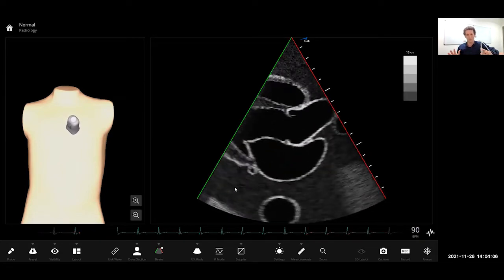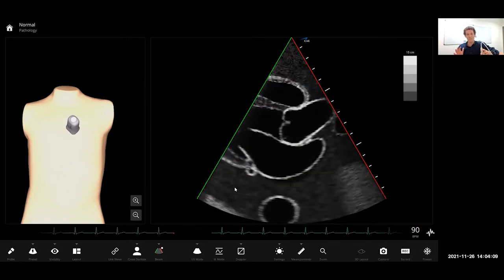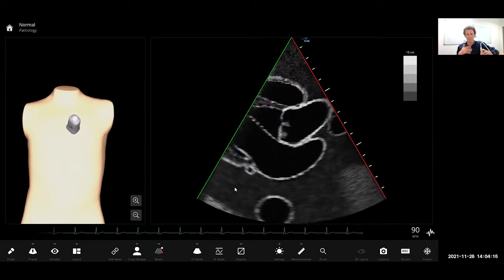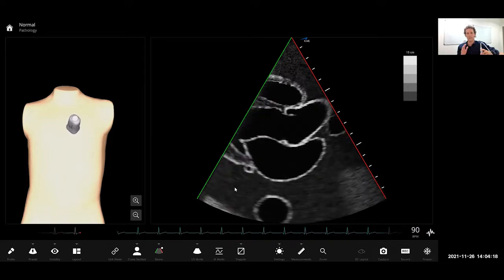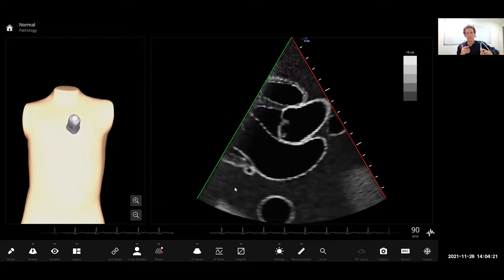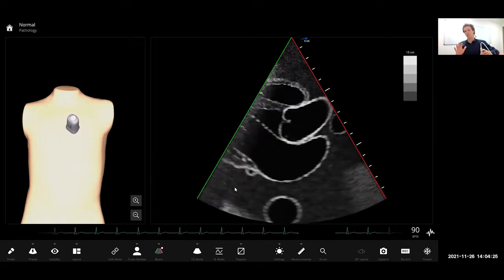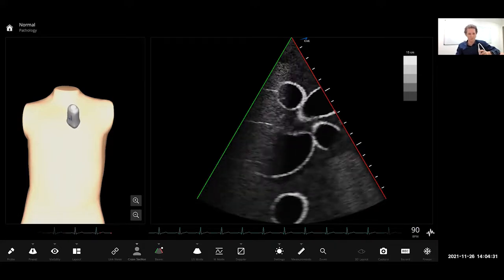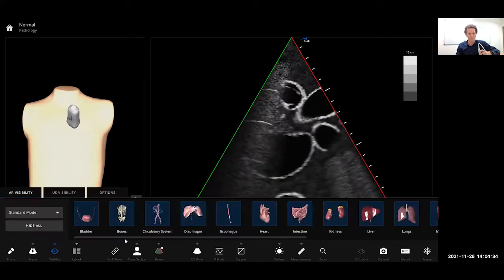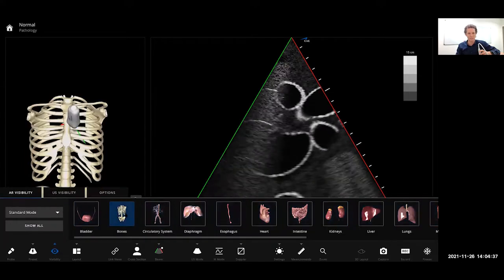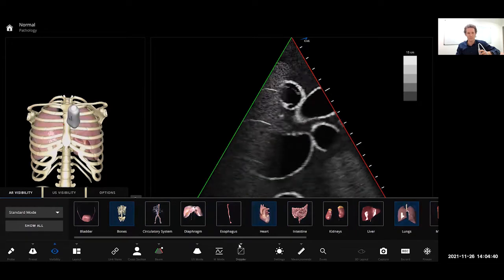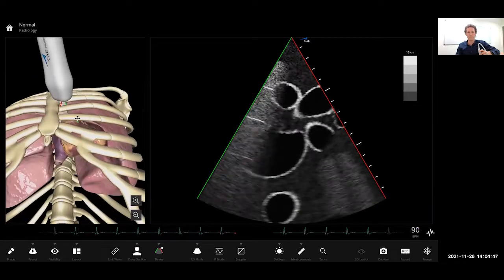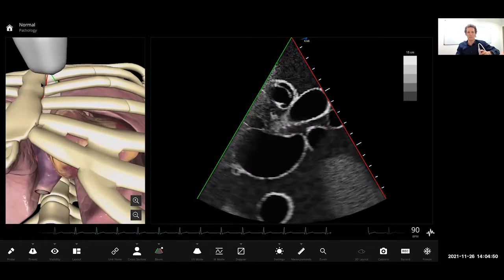Critically ill patients are obviously not always the easiest to image. I'm going to presume the audience knows a bit about imaging and is starting to use Doppler. As you start to do more advanced stuff it can be tricky, but you've got to use all the tips and tricks you can. The first thing to say is that when we're doing our parasternal imaging, you've got to be tucked in right next to that sternum.